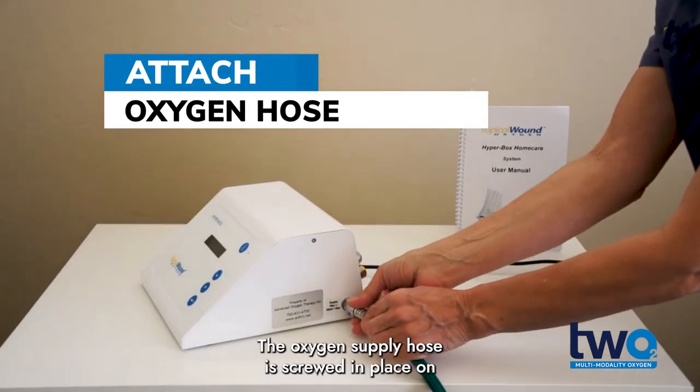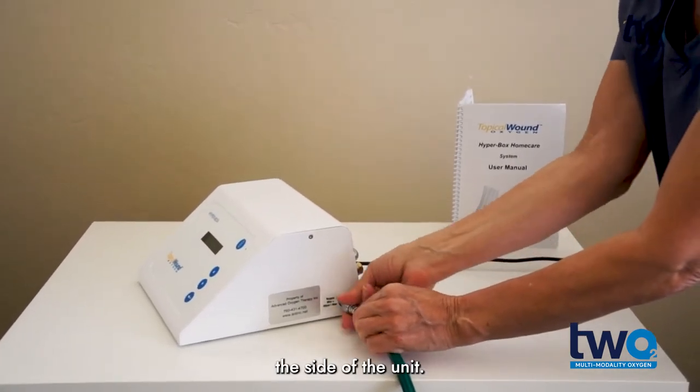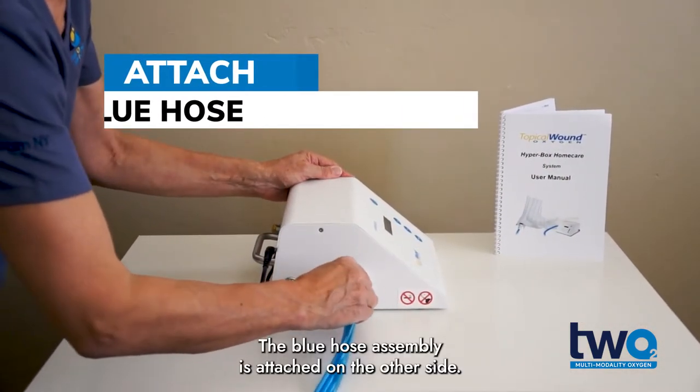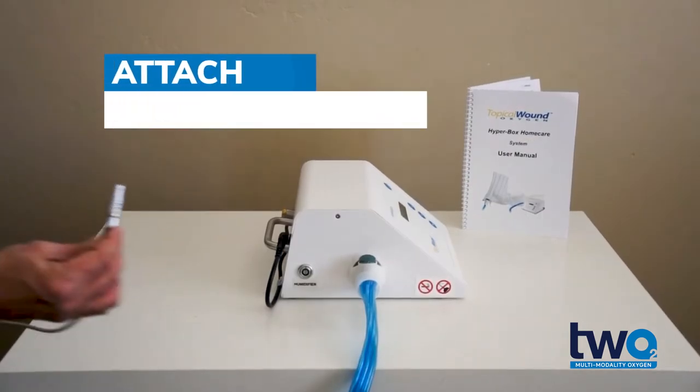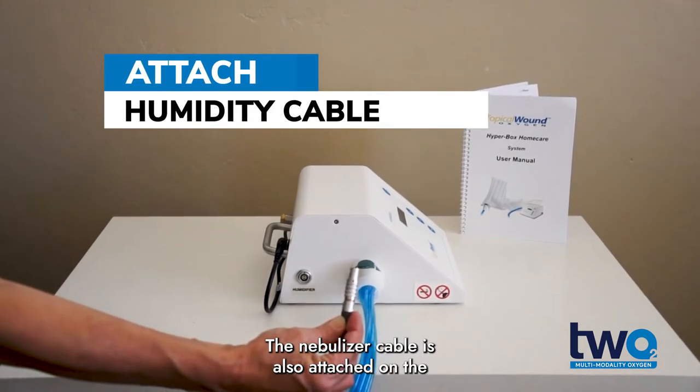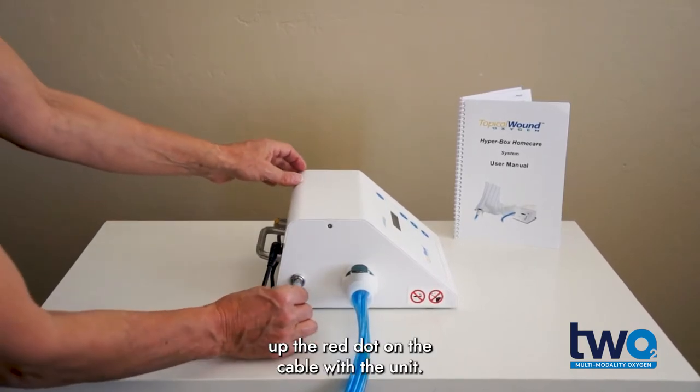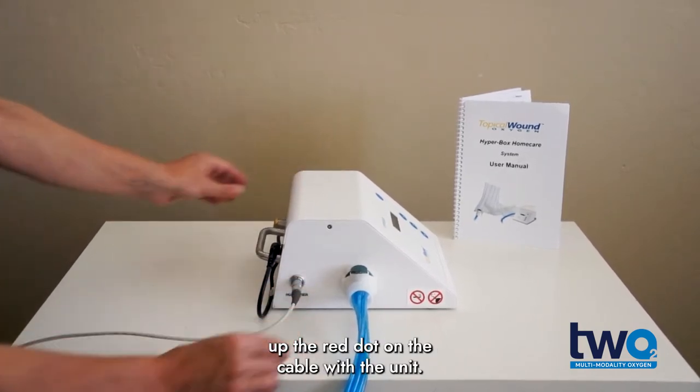The oxygen supply hose is screwed in place on the side of the unit. The blue hose assembly is attached on the other side. The nebulizer cable is also attached on the same side as the blue hose assembly, lining up the red dot on the cable with the unit.